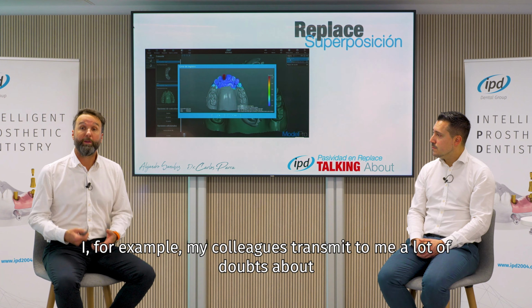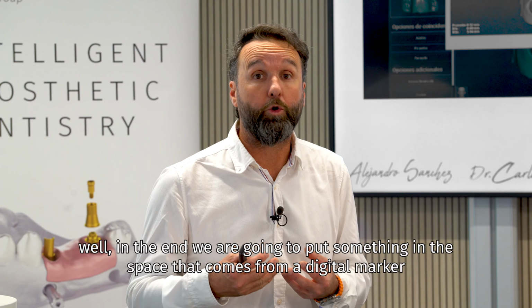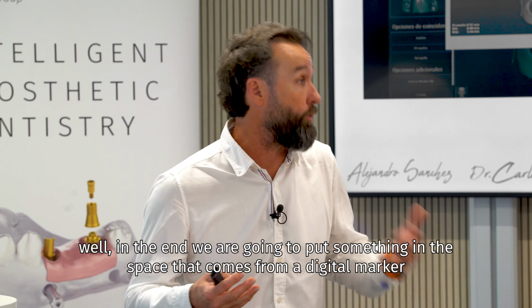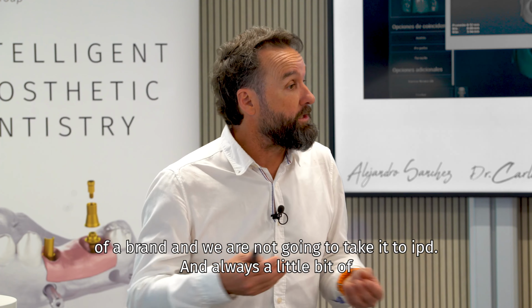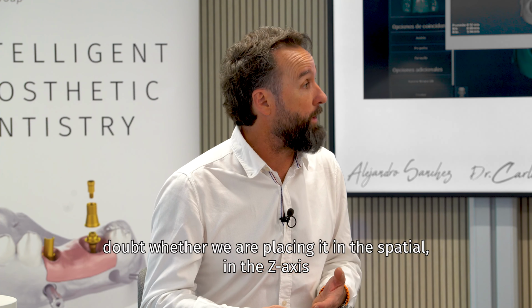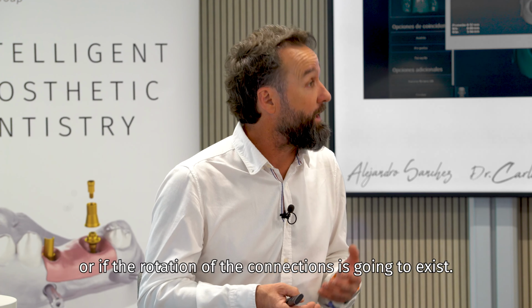For example, my colleagues transmit to me a lot of doubts about, well, in the end, we are going to put something in the space that comes from a digital marker of a brand, and we are not going to take it to IPD, and there is always a little bit of doubt whether we are placing it correctly in space, in the z-axis, or if the rotation of the connections is going to exist.